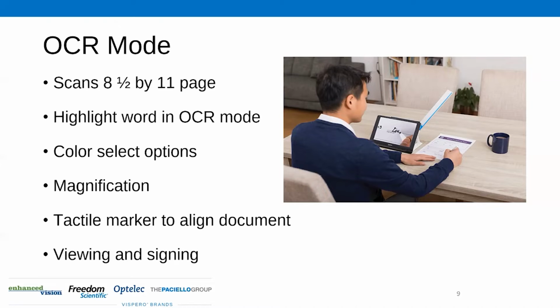And I also want to mention, while we're talking about the OCR mode, this does come with multiple languages. So it's not going to translate. Translation is always difficult. But if you have something in Spanish, German, French, Italian, there's a wide, long list of different languages that this can read to you in. And so if you scan something in Spanish and then you change the voice to a Spanish voice, this will read it to you with the correct inflection and everything. And I know that we've tried this with customers, and they're always impressed by the voice when it's reading in those different languages.